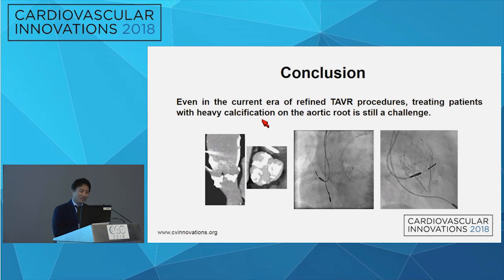So, in conclusion, ladies and gentlemen, even in the current era of refined TAVR procedures, treating patients with heavy calcification on the aortic root is still a challenge. And thank you for your kind attention.